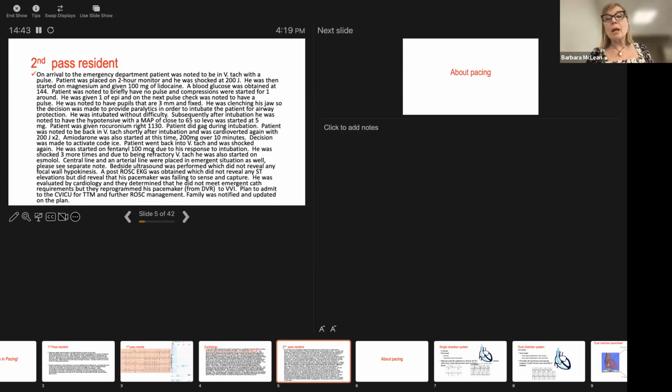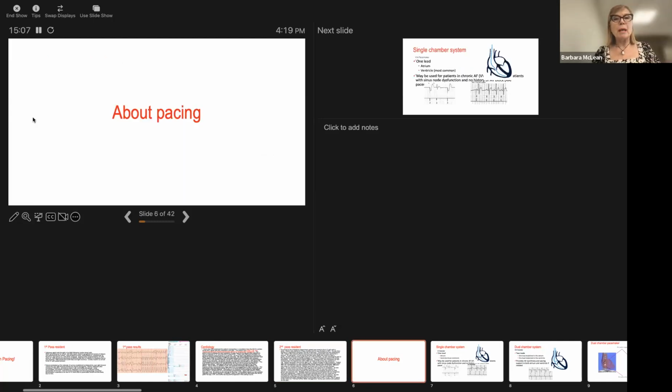Okay. Now, lots of times people say, oh, the pacemaker is failing to sense and capture, when in reality, it might not be that at all. That's pretty sophisticated. We need an electrophysiologist to look at that EKG and to also know how that pacemaker is supposed to be operating. Okay, so that's kind of giving you this basic history.